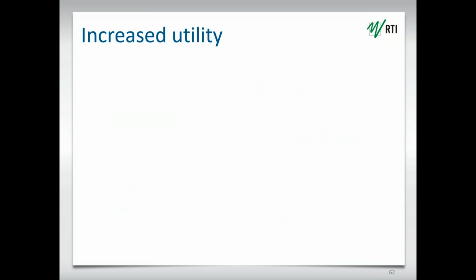So this is what we're trying to do. We're increasing customizability, of course. But this doesn't stop at the reporting. We're trying to increase the utility of the software here to improve the efficiency of the work.